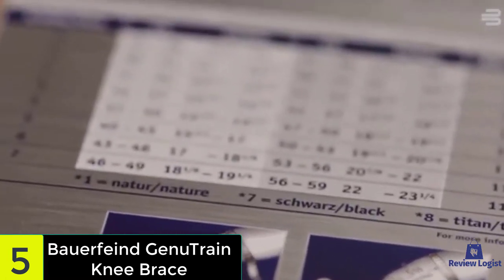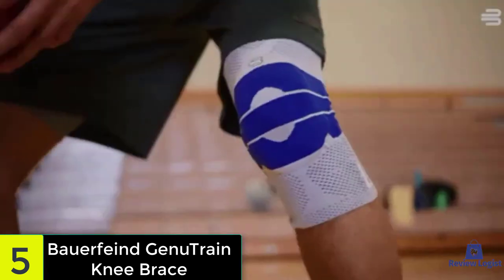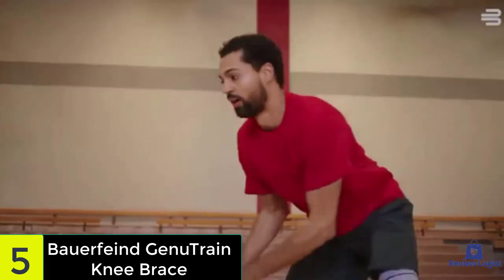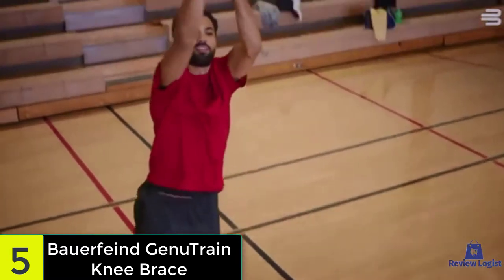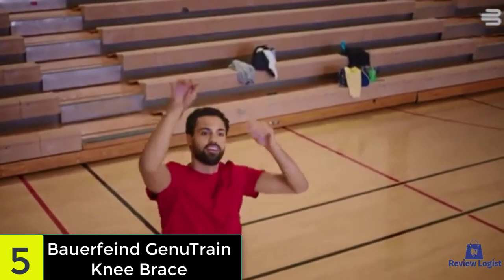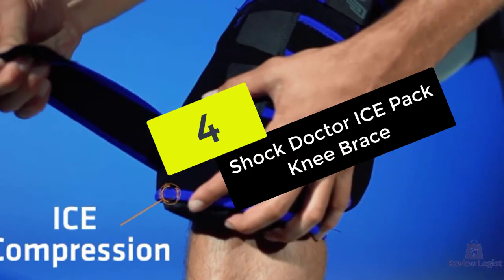One of the many improvements made to the Genutrain Knee Brace is the omega pad, which offers excellent patellar support and reduces pain and swelling around the kneecap. This knee brace is surprisingly durable when it comes to everyday use, and there are no special instructions when it comes to cleaning it — all you do is just toss it in the washer.